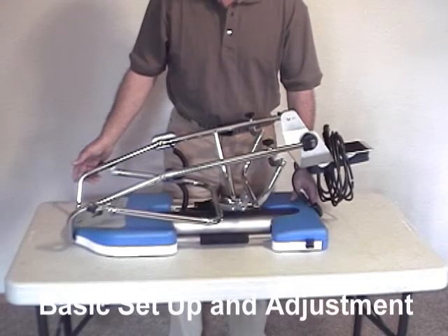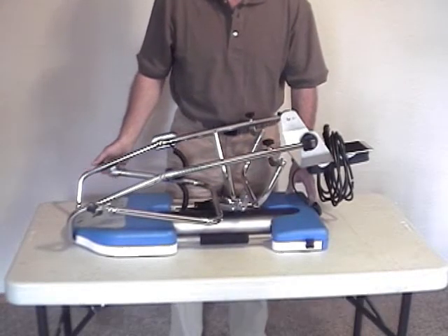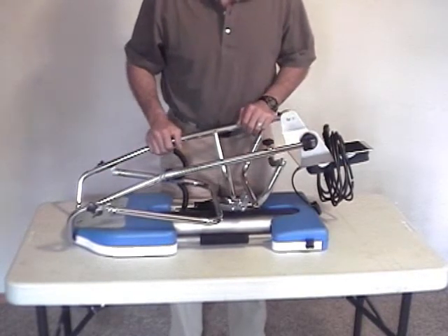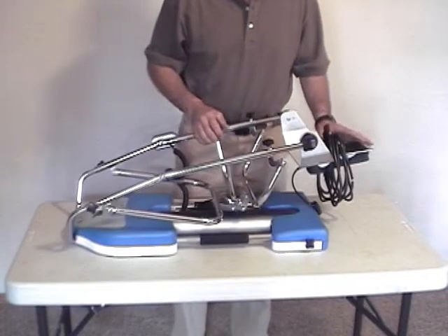This is the RFlex Knee CPM from Sammons Preston Patterson Medical. I'm going to show you some of the adjustments and settings of this machine.